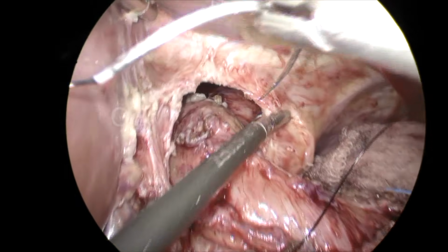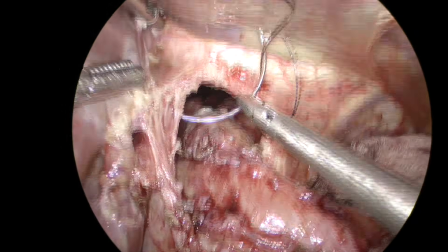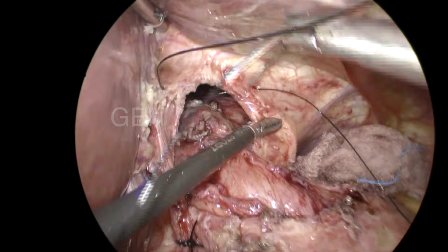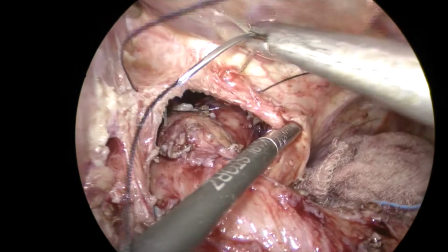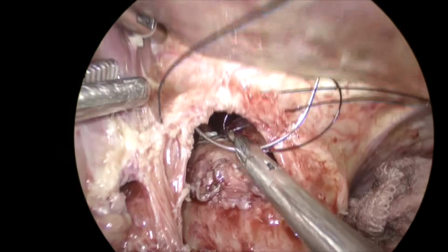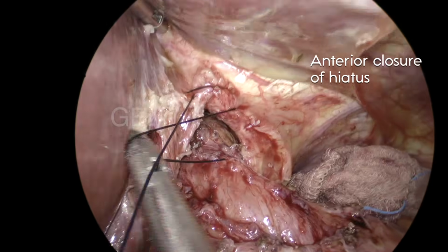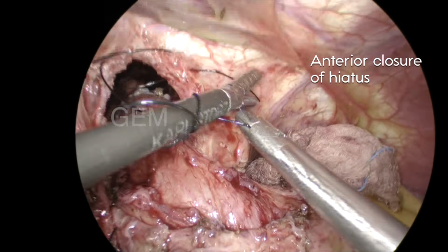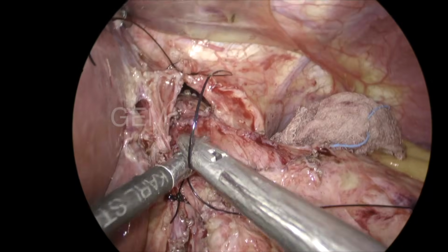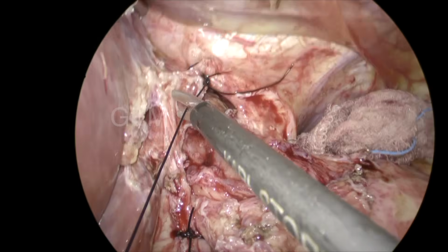So I started suturing the anterior hiatus. Hiatus approximation in Heller's is a little controversial. Many people are not doing it. They say the patient already has dysphagia, so why make dysphagia again? But dysphagia is not because of the hiatus crus. Dysphagia is because of the non-working circular muscle. But the hiatus should be corrected in Heller's cardiomyotomy if you feel it is a wide hiatus. It need not be corrected like in GERD patients.